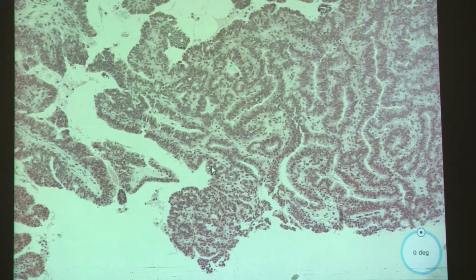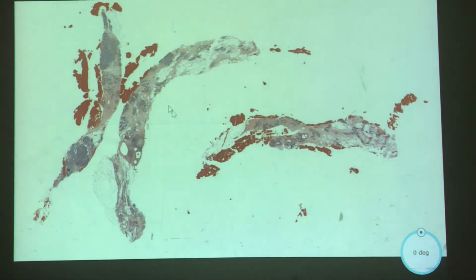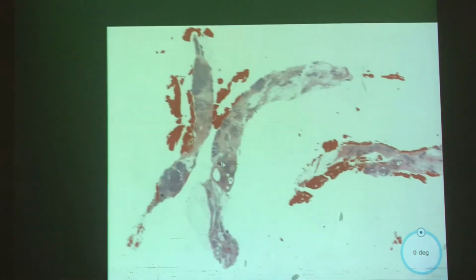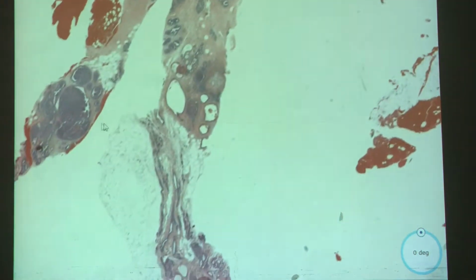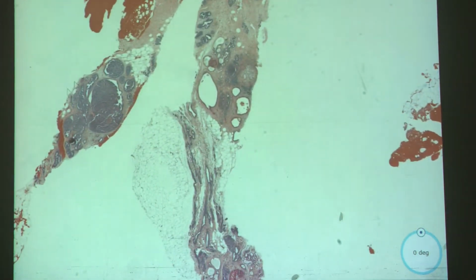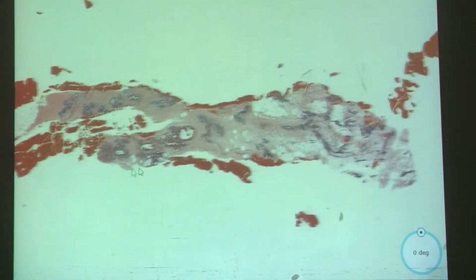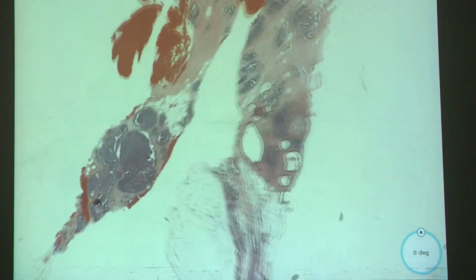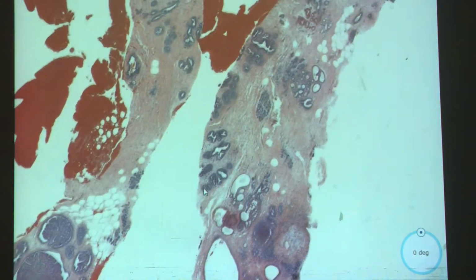Final answer, okay. Well, hold on to that thought, because I'm going to give you another case. Okay. All right, so again, more core, some blood this time, a little more fibrous than the previous one. Yep. There are some sort of duct areas that are similar at low power to the previous case, just stained a little darker here compared to the previous. So I'm assuming this will be the area of interest. That is the area of interest.